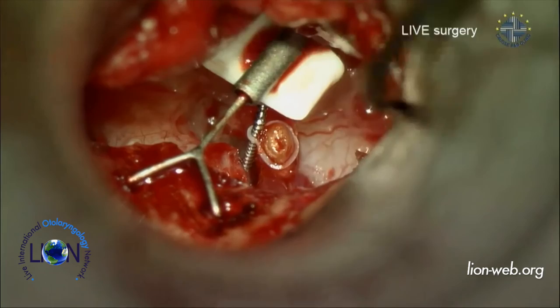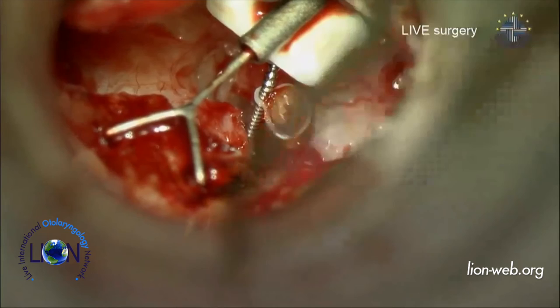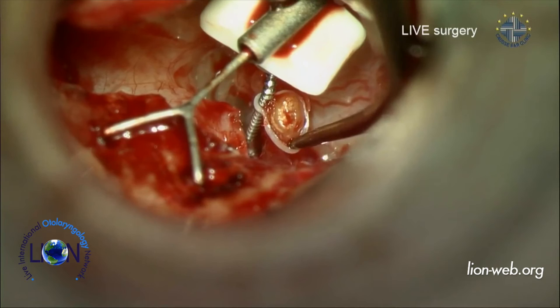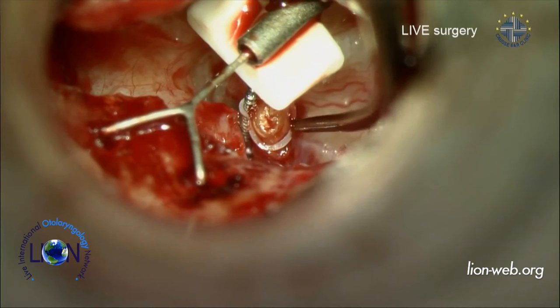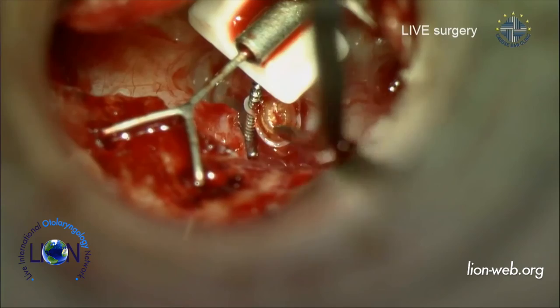Maybe I could try to push the band a little bit more down. I see if I can do it. Not quite. I would like to place it underneath this kind of residual tissue, but it's quite fine here. Maybe it would be slightly better, but it's going to be difficult. No, I can't do it. Sometimes getting it to slip down the notches on the shaft is a little bit difficult in this situation, isn't it? Yeah. I think it's fine because it's very hypermobile. I don't want to mobilize too much, so it's fine.